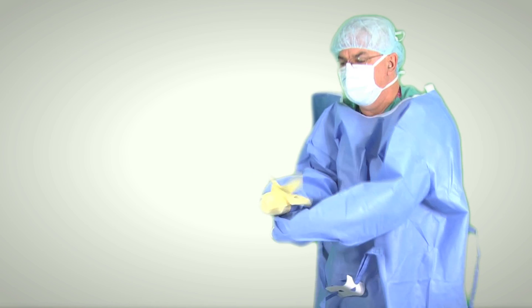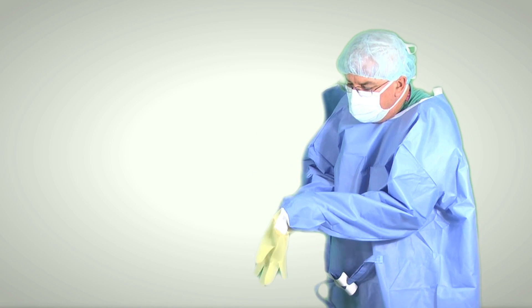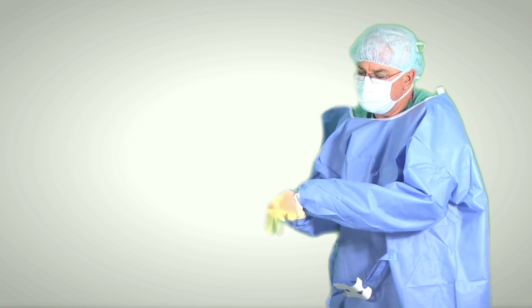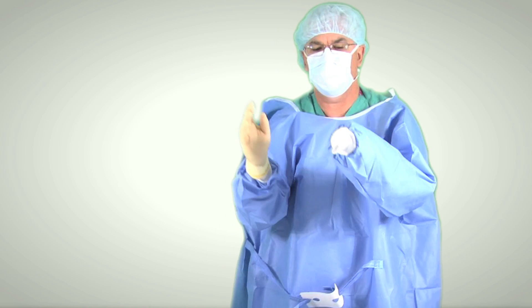You see how my fingers are pointing up? I'm going to get them hanging down. Then that way, I can easily put the gloves the rest of the way on. And notice this white thing isn't all the way up here.